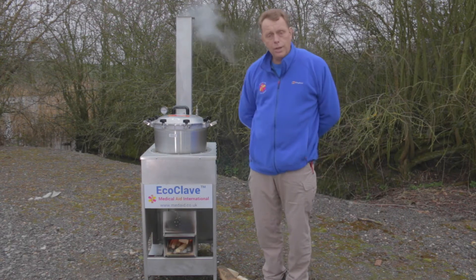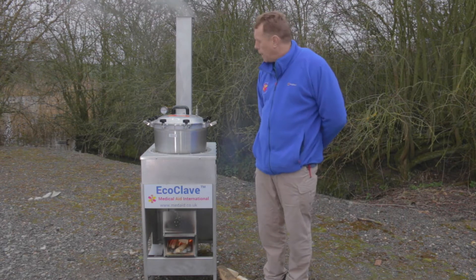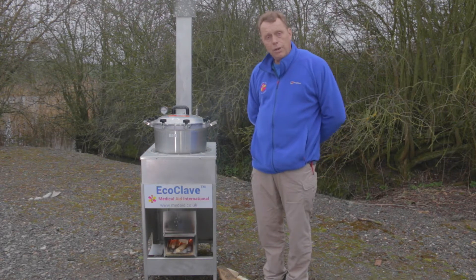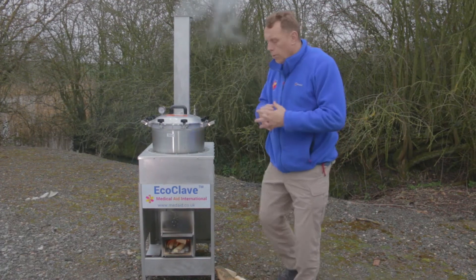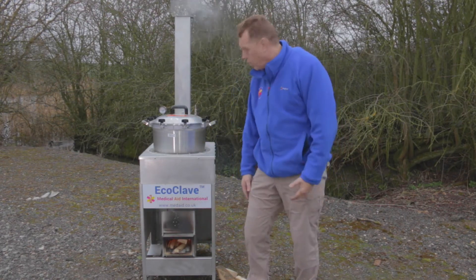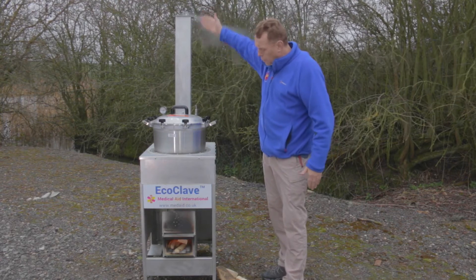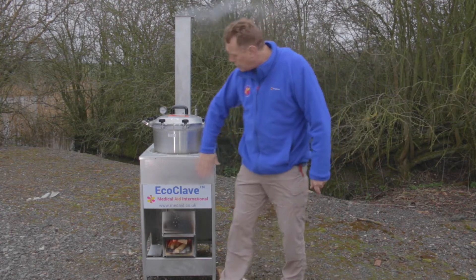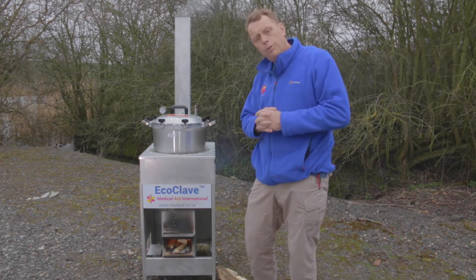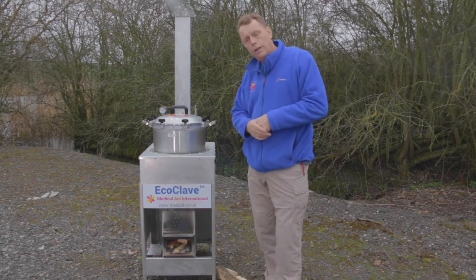This device here, the EcoClave, is designed to address that problem by using heat very efficiently from a wood fire, which you can see at the bottom, and being able to maintain that heat so that the pressure in the pressure cooker autoclave is maintained and sterilisation actually takes place. The fire works on a draw-through effect like any wood burning stove. The heat goes around the pressure cooker autoclave and out of the chimney. This whole area, including where the fire is, is lined with fireproof insulated material, meaning the heat stays in and warms up the autoclave very effectively.